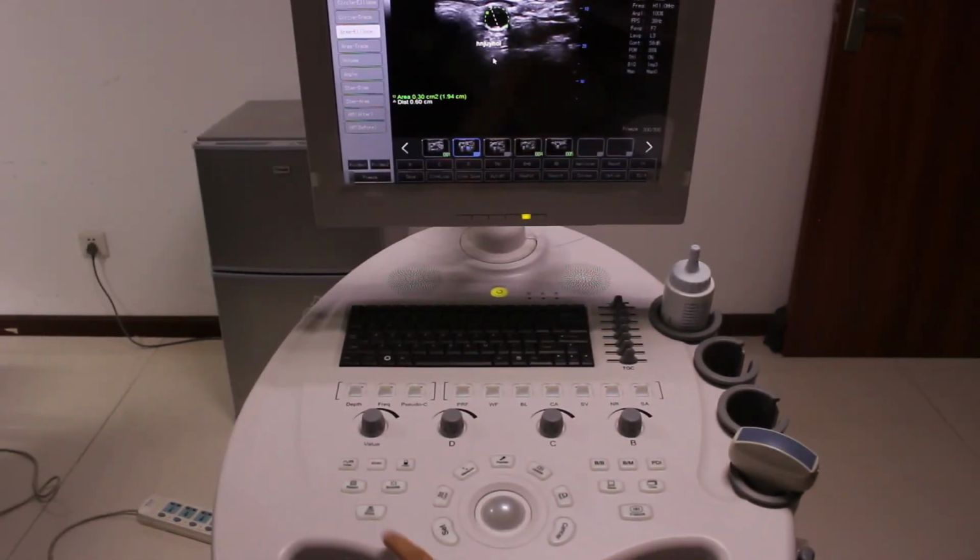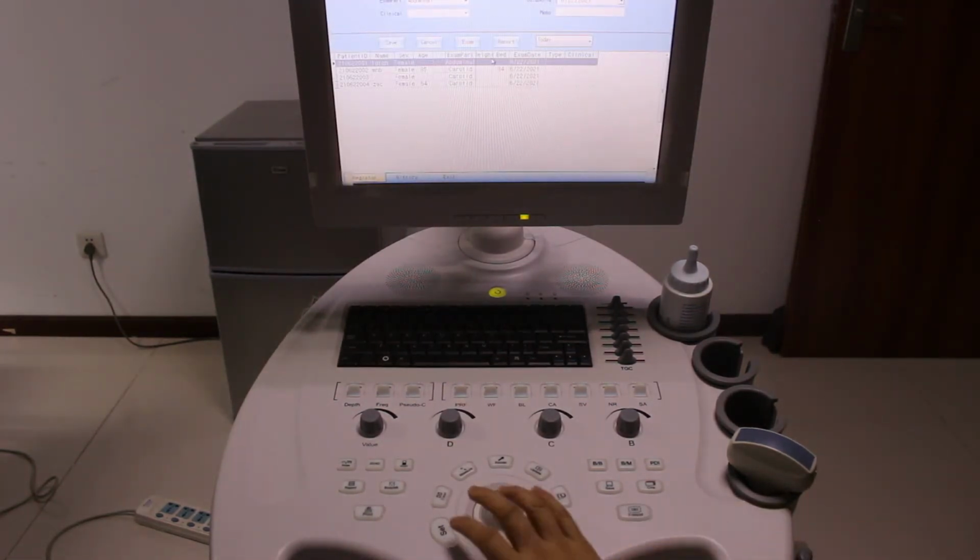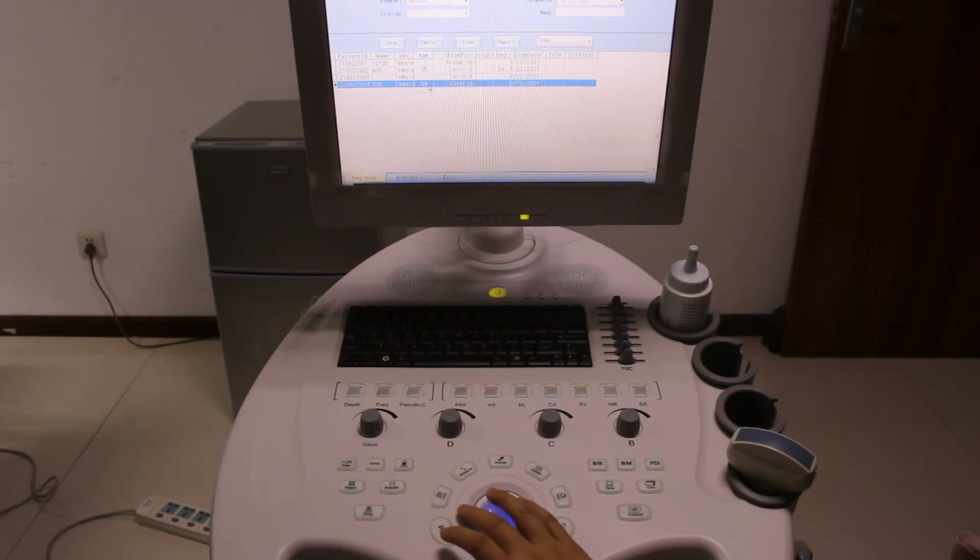We go to make a report. Press report. We go to find the patient. From this register, you can find all of the patient data here. This is the patient that you have done today. But if you want to find yesterday or the day before yesterday, you can choose it from here. In 2 days, in 3 days, in 4 days, in 5 days. Then you can get it all.